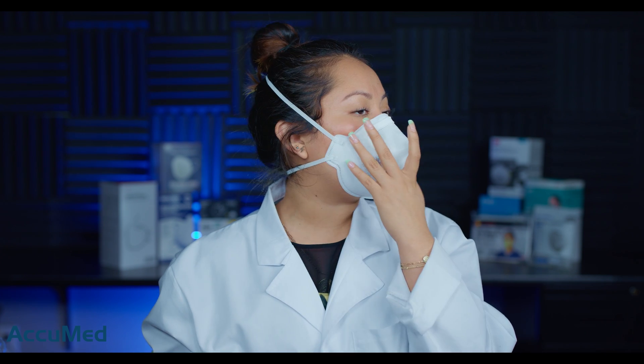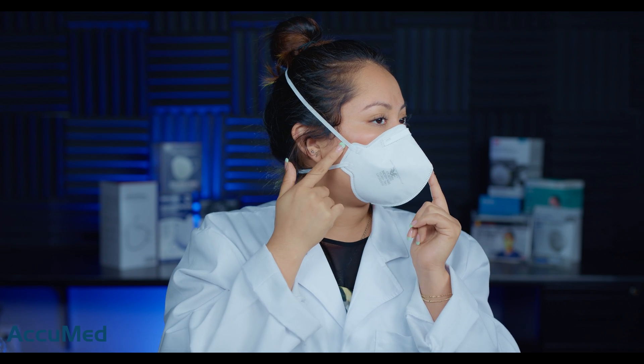We're going to see how they test. In terms of fit or sizing, I would say these are maybe like a small-medium because they actually do fit my face properly. As I mentioned about the headbands, they are digging on the side of the face. The nose foam is not the best quality, so I am getting some discomfort on the bridge of my nose.